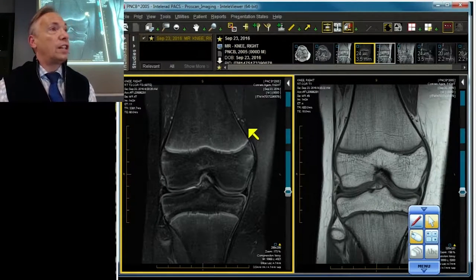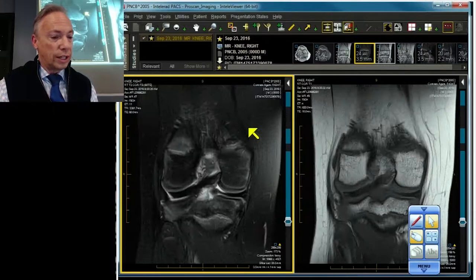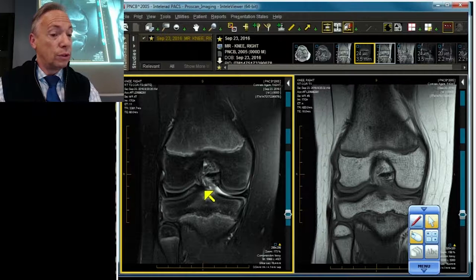It's very hard to tear anything in a child because the tissues are so healthy and resilient. There is our lateral meniscus, our root, and our very well-established, beautiful, dark root ligament — the posterior root ligament on the lateral side.